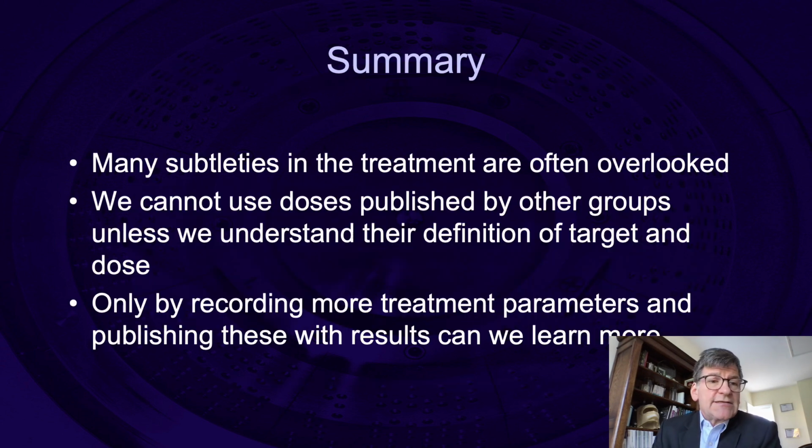So to summarize, there are many subtleties in the treatment that are often overlooked. We cannot use doses published by other groups unless we understand their definition of target and dose. And only by recording more treatment parameters and publishing these with results can we learn more.